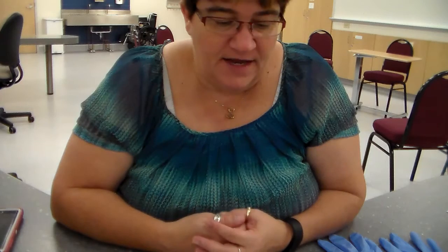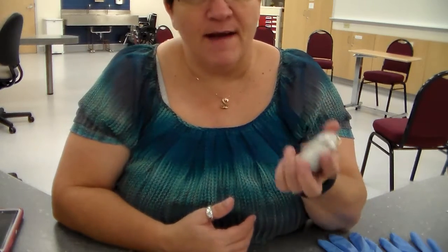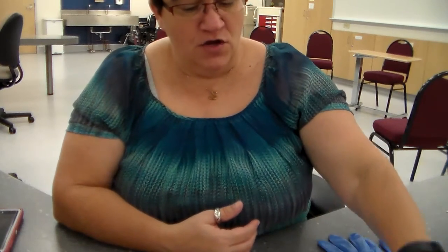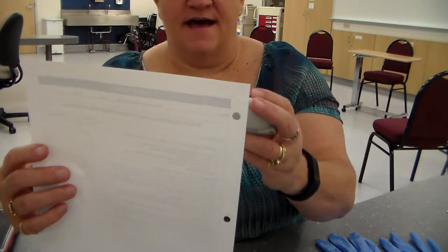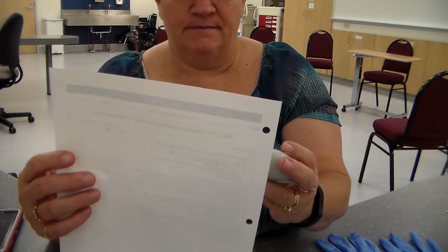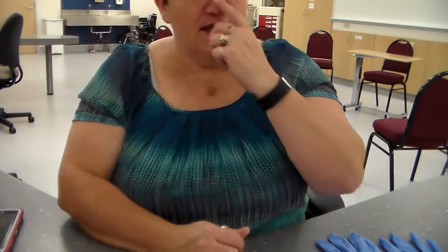You're going to check the medication label 3 times for safety. You're going to check it when you take it out of the medication drawer and say, yep, I grabbed the right one. And then you're going to look at the expiration date, see if it's okay. You're going to compare it to the MAR and say, yep, that's what I'm supposed to have. Is it the right med, the right dose, the right time, the right route? Don't forget the 6 rights to your patient medication.